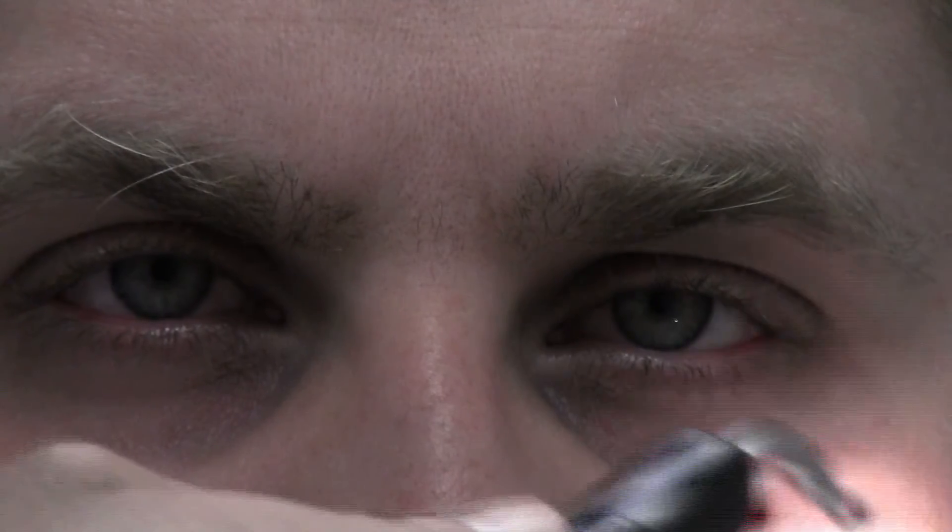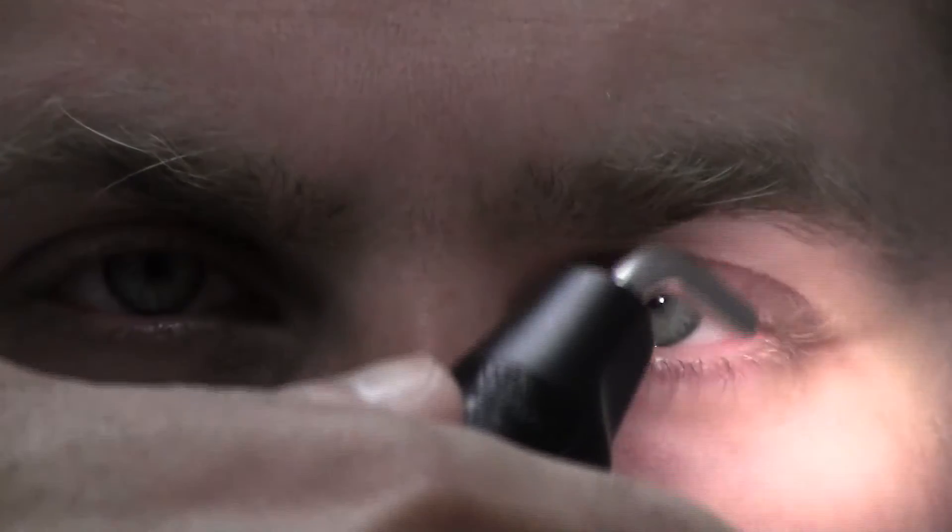After three seconds, I switch to the other side. If this pupil has something wrong with it — something wrong with the nerve fiber in this eye — it doesn't register as much light entering that eye. The pupil would dilate. Both pupils would dilate because of the direct and consensual response. That would be a positive RAPD sign in this eye.